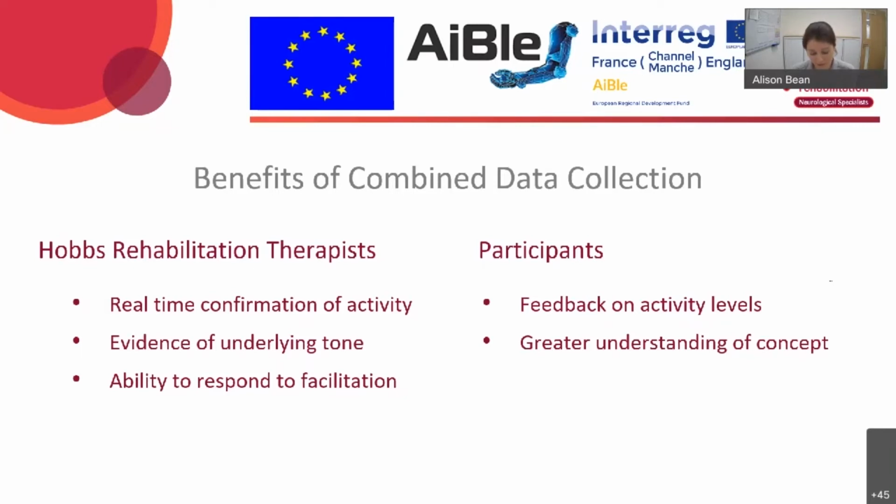And then for the participants, when we showed them the EMG signals during their movements, they were really positive about getting immediate feedback on their activity levels. And with explanation of what those signals showed and meant, they could understand more about what they were moving. This wasn't part of the trial, but the experience of data collection really highlighted how effective an adjunct this can be to our usual therapy feedback and modulation methods. And within the trial, it also increased participant understanding and therefore their satisfaction of taking part. Next slide, please.